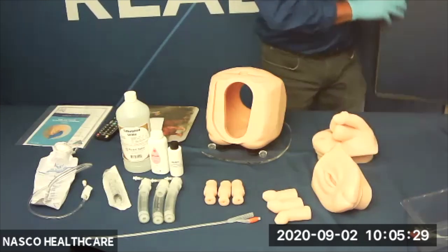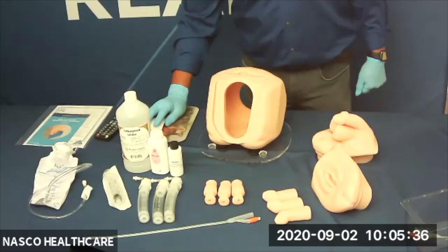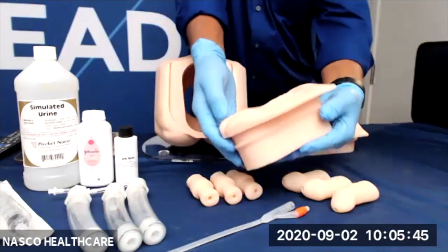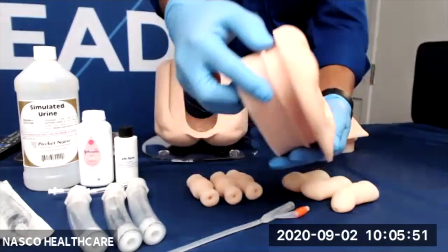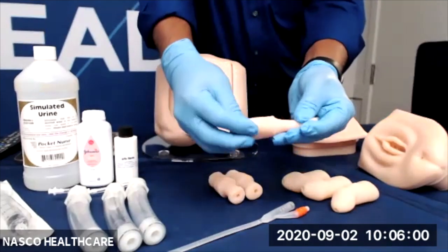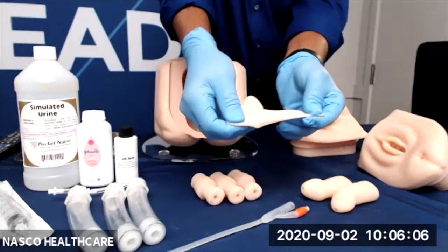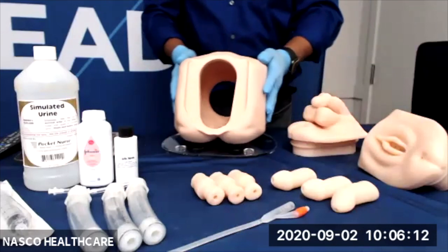Khaled is going to show us a close-up of the skin. As you can see, the skin is very lifelike, long-lasting, and quite durable. It promotes better representation for clinical education and procedural task learning. The skin is made from a soft silicone that looks and feels more natural, offering a more realistic manipulation of the skin needed to complete the necessary steps in catheterization.